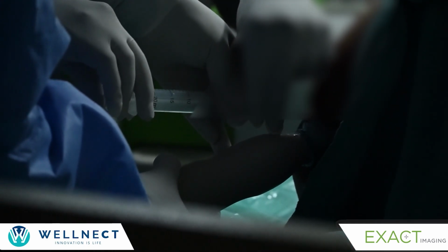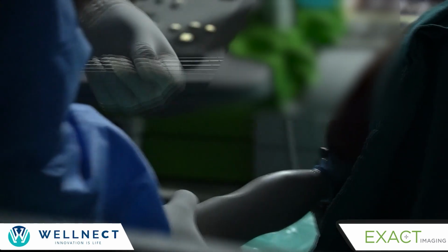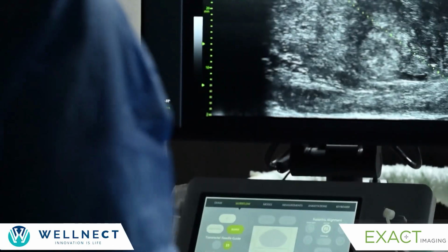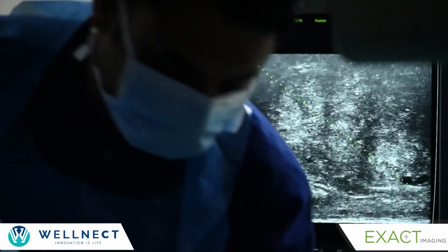Can you see the fluid over there? There's the fluid which is getting injected. Now this finishes the local anesthesia. Now we would keep our target. So can you just hold this? So now we have this done from the bar.